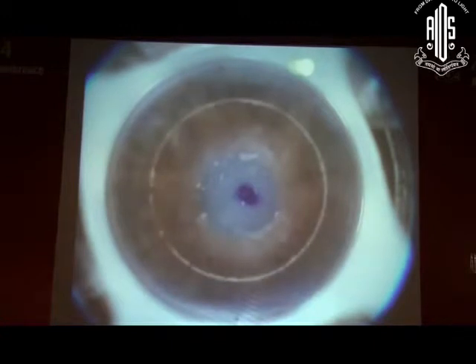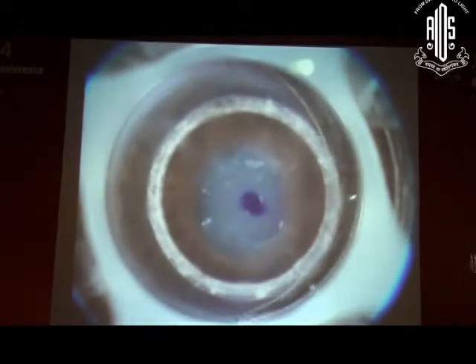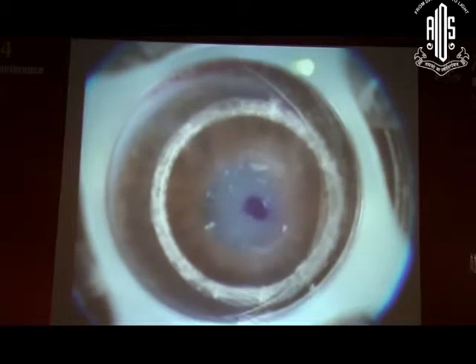Loss of suction has happened once. Here's a patient with lattice corneal dystrophy, planning to do a femto-DALK. The patient, I can't blame him, was not squeezing, with normal corneal curvature. Watch this fluid meniscus over here. So I'm halfway through the treatment, I'm about to start the anterior side cut, boom, lost suction.